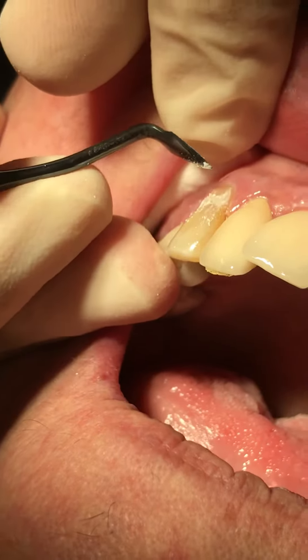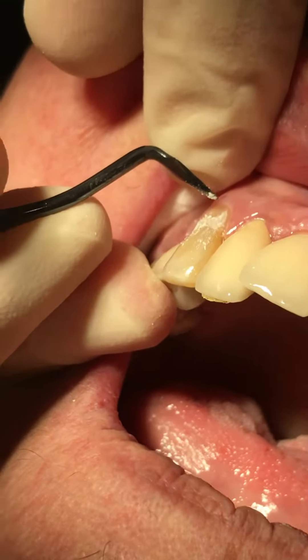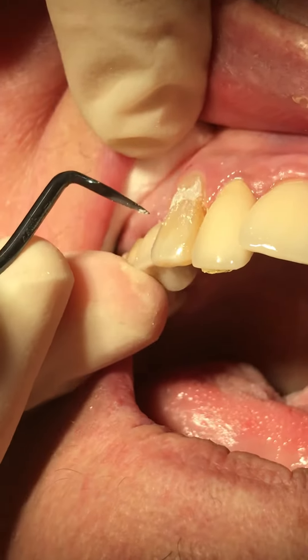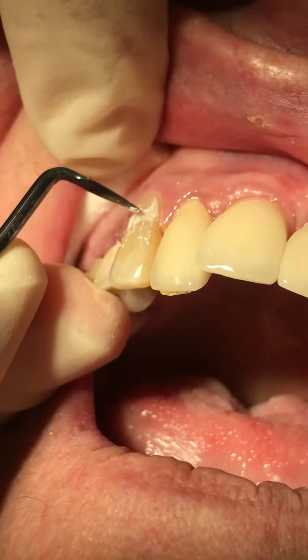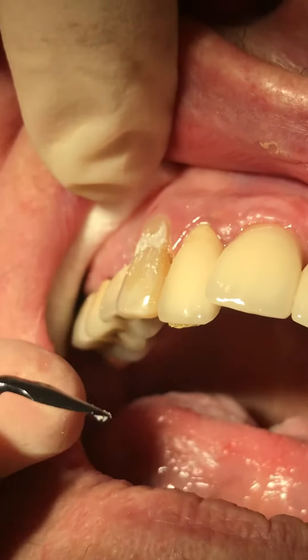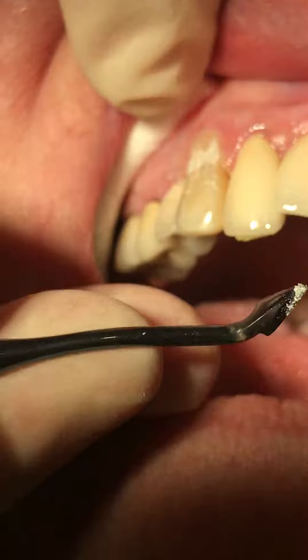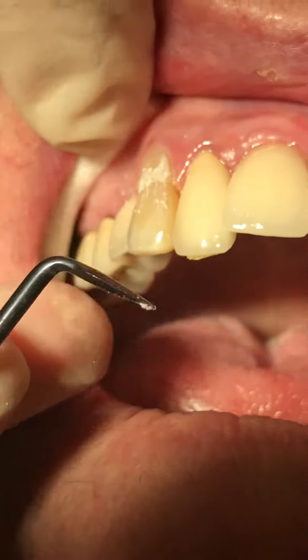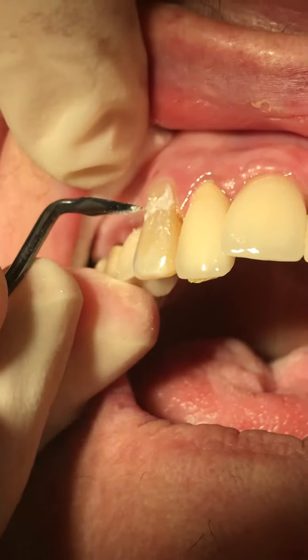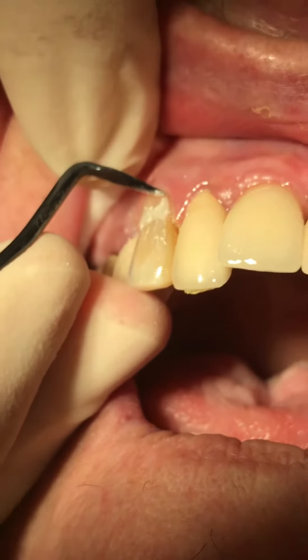I have just placed a class 5 composite restoration and I have intentionally overbuilt it slightly, just to demonstrate the cutting efficiency of the compo tools. We'll be using two instruments, and as I said, I've overbuilt it slightly just to show how they cut.